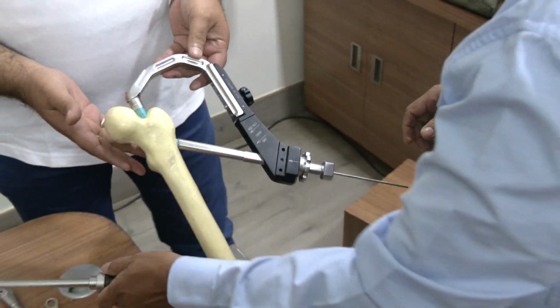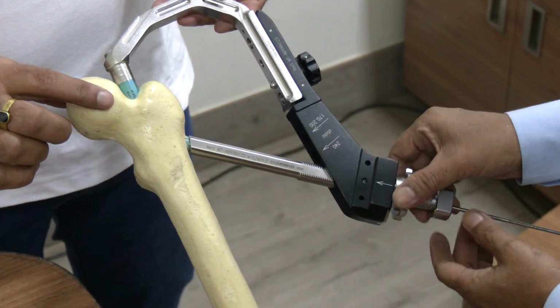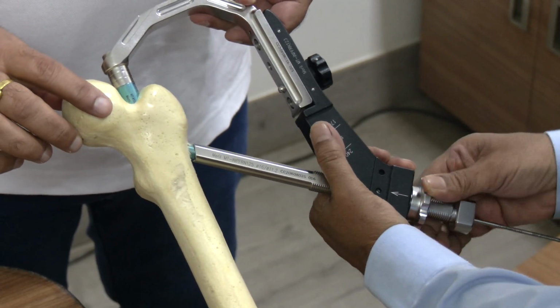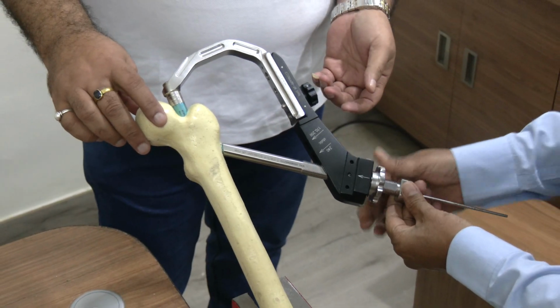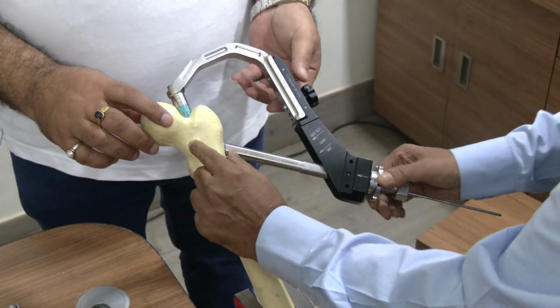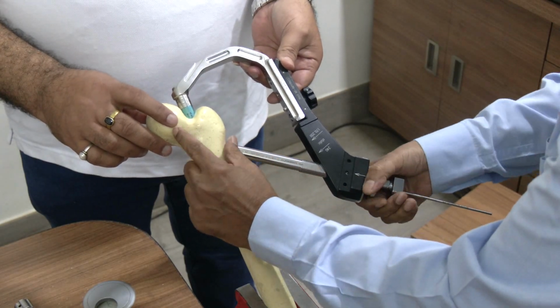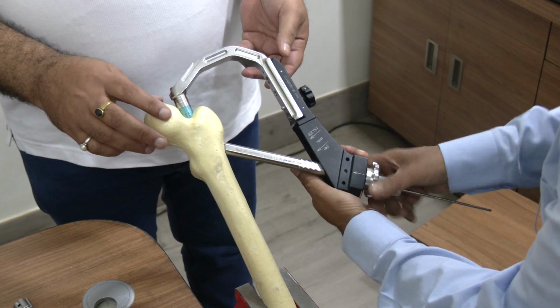So at this stage, if you are still not happy with the fracture compression, you can still compress using this system. You can just try to push the lateral cortex inside. That will achieve a little more compression. So passing the helical blade part is over.